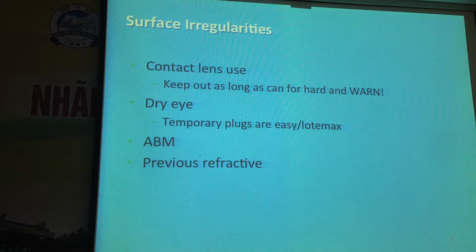So these people need to be discussed a little bit closer, because when you do refractive surgery, whether it's LASIK, that makes it a little harder to hit that calculation just right. And we all know there's different formulas, or we do in the U.S. We know there's a lot of different formulas to get it right. When you calculate for all those different formulas they have for people that have had refractive surgery, it's amazing how different the results are. And so those people need to have special consultation to understand when I'm done putting the lens in and when we're done with the refraction, your care for that cataract, we may have to touch that up, because in reality, it's really hard to get that just right.